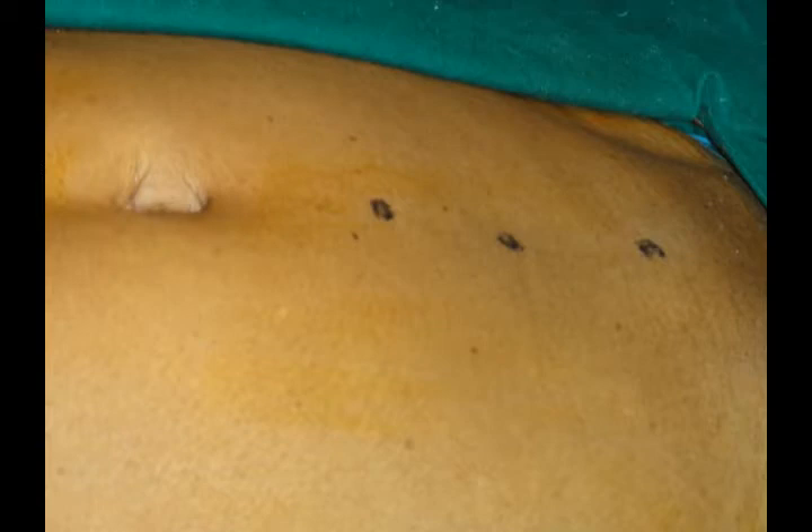This is a patient — you can see three markings. The one closer to the umbilicus is for introduction of the camera; that's the camera port, the top one. The middle one is for the right hand operating, and the lower-most suprapubic is for the left hand. So all three ports are in the midline.